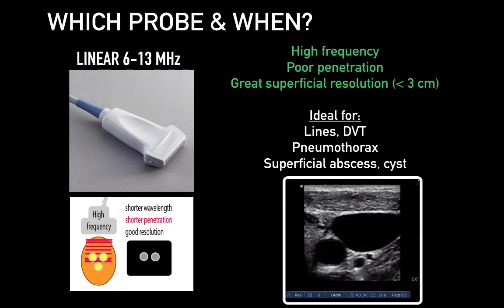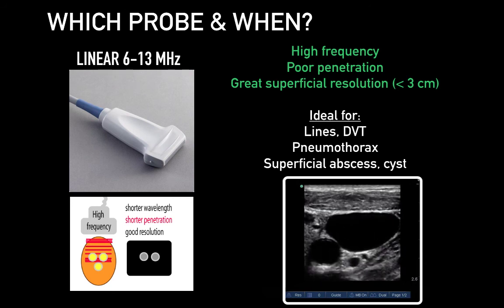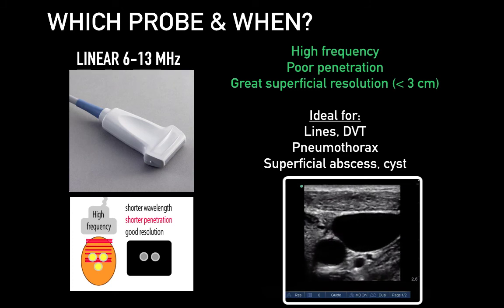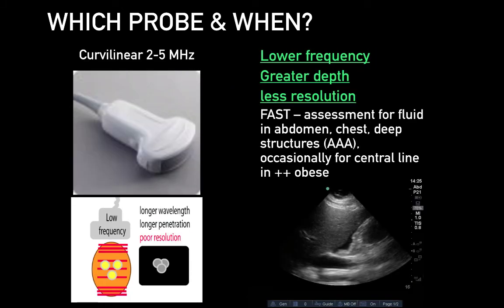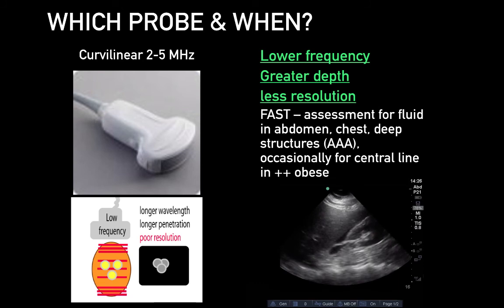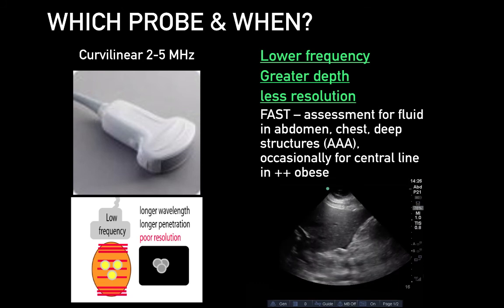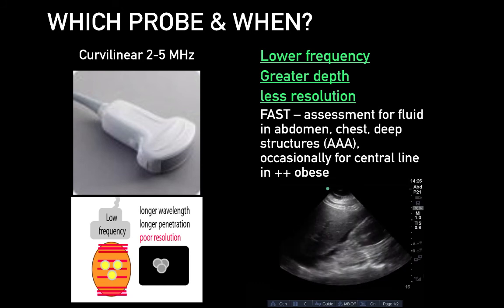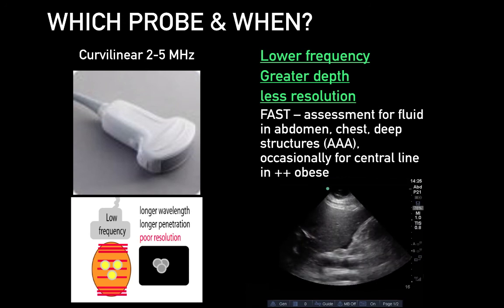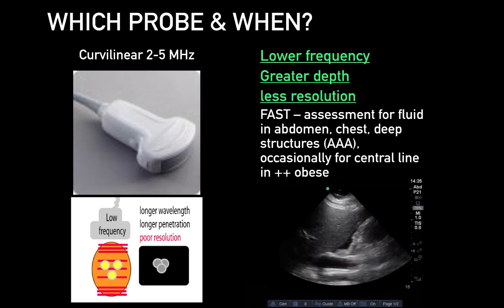As demonstrated on this 2D image, we can see that really high-quality resolution and visualization of soft tissue. The curvilinear probe is 2 to 5 MHz in the lower frequency range — it gets great depth but less resolution. This is often used in the FAST exam to assess for fluid in the abdomen, chest, and deep structures. It is very useful for abdominal aortic aneurysms and can occasionally be used for central line insertion in the very obese.